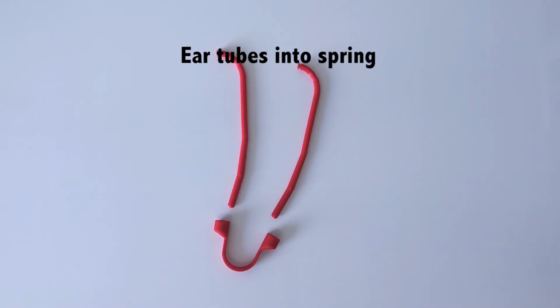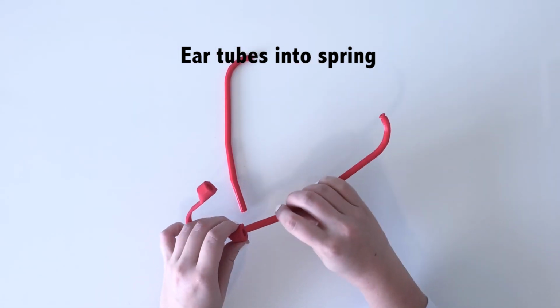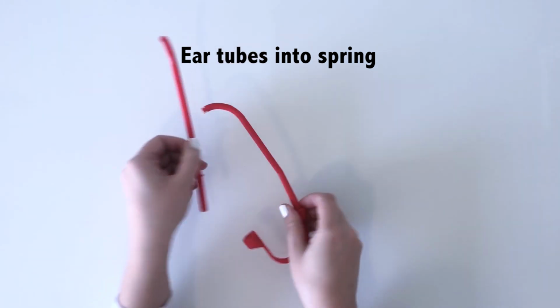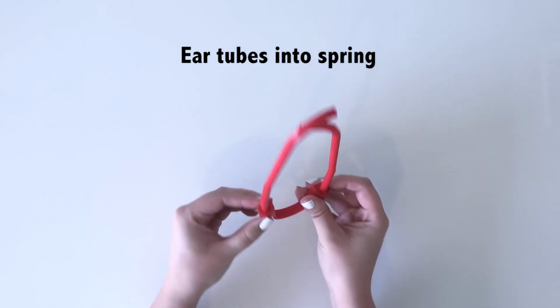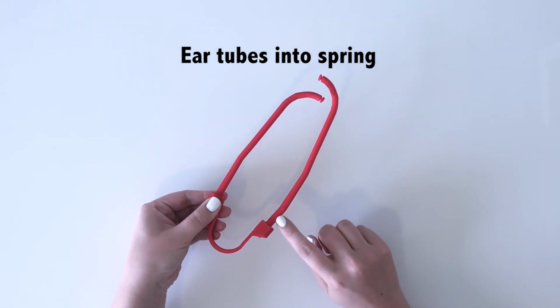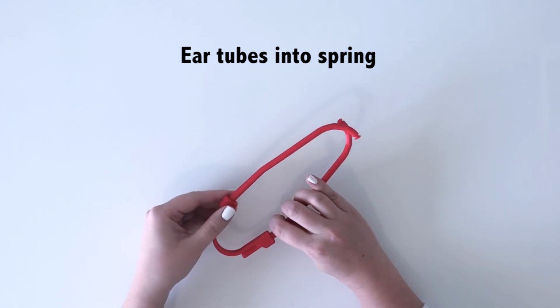With the curved ends of the ear tubes facing in, push the ear tubes into the spring. If you're having difficulty, check that the ear tube is properly aligned with the spring opening, as they both have an oval shape. You may notice a small bump on the inside of the ear tubes. That marks how far they should be inserted into the spring.